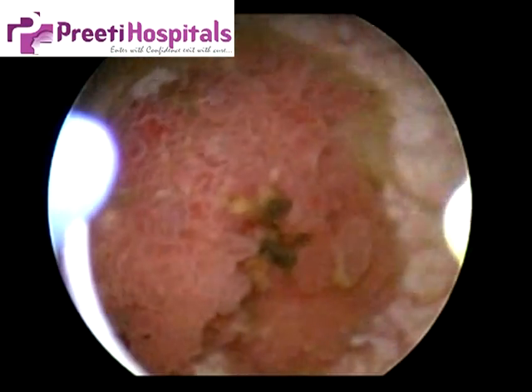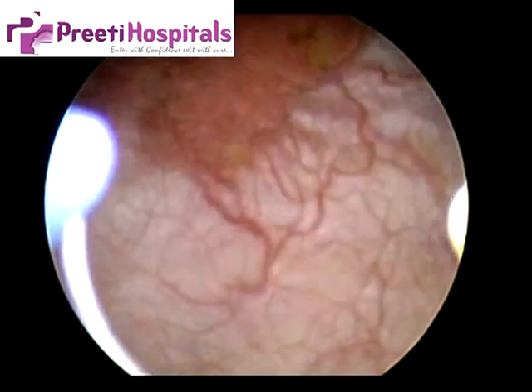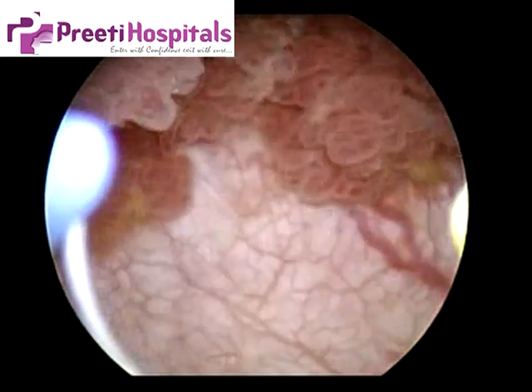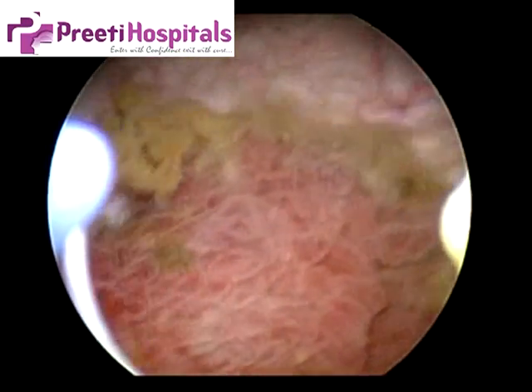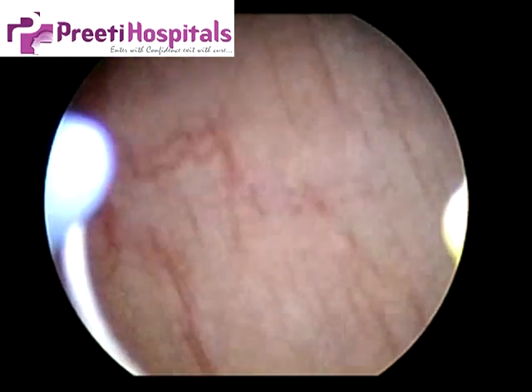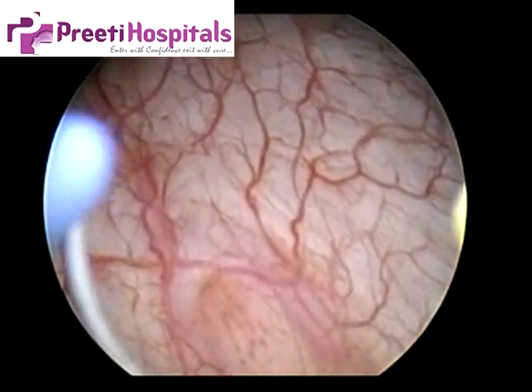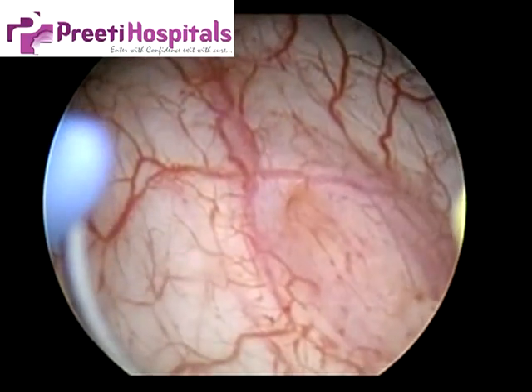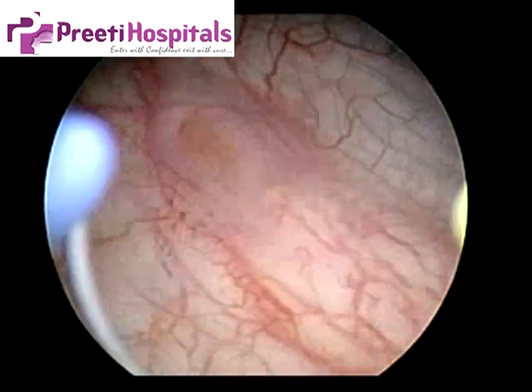You can see the calcifications also on the tumor, which is not a good prognostic sign. These are the vessels which are supplying the tumor. Now we will cut the tumor with bipolar. The advantage of bipolar is the current will not go outside. This is the ureteric orifice, so it is nearly 2.5 centimeters above the ureteric orifice.